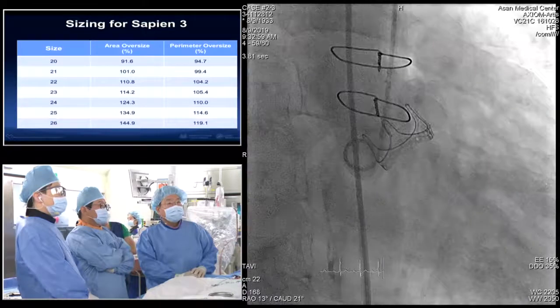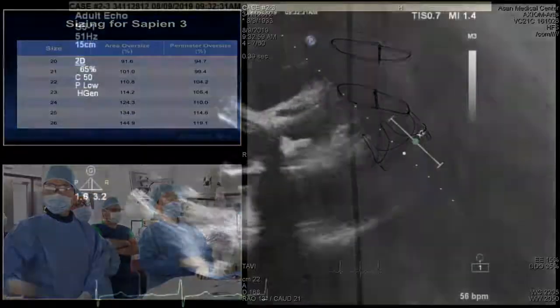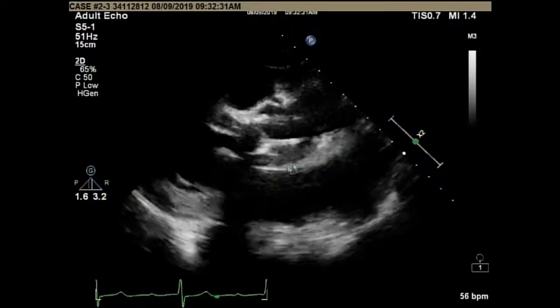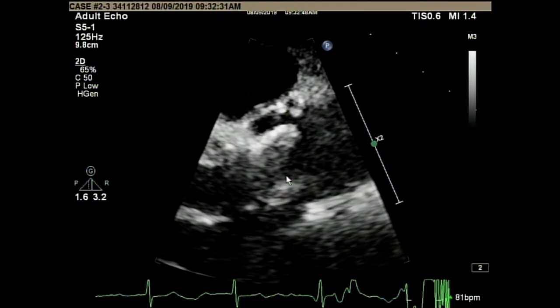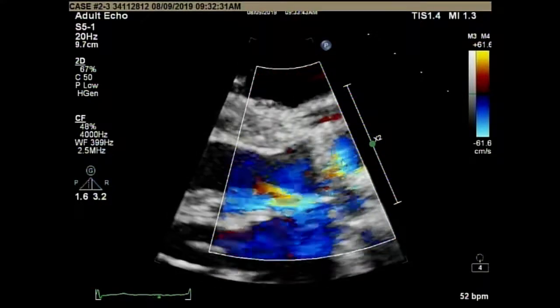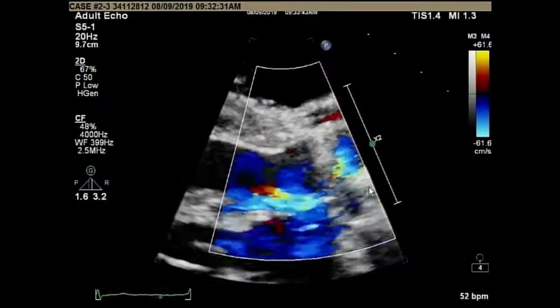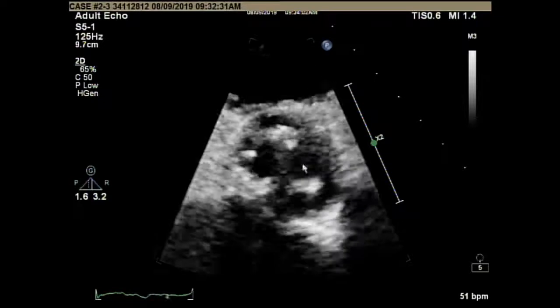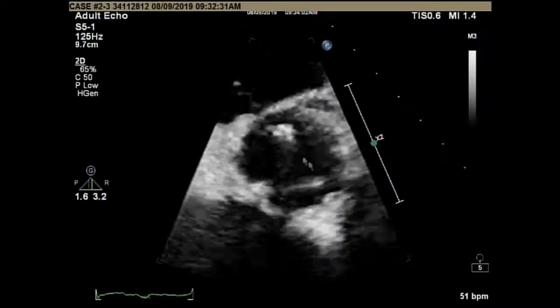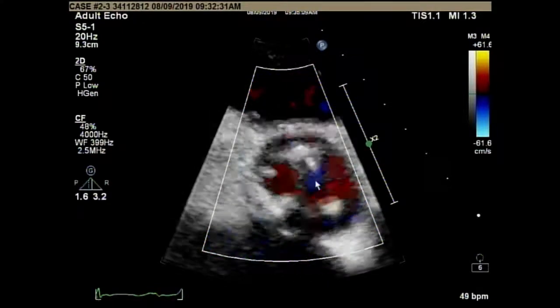Did you see the angiogram over there? All right, our professor will give us some echocardiographic findings. Can you see the echo image right now? This is the parasternal long axis view. You can see the bioprosthetic valve right here. In magnified view, in color flow image, you can see a big PISA right here and an eccentric jet here. According to the PISA size, it indicates severe AR. I'm not sure which one is flail leaflet because this is a still image. The previous TEE report shows the left coronary cusp was flail. The jet right here indicates flail motion of the left coronary cusp.